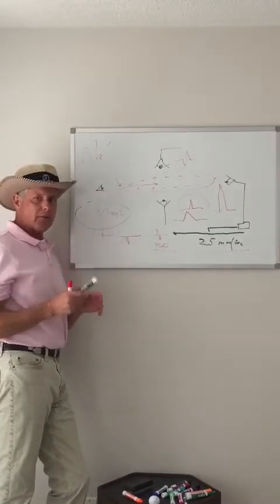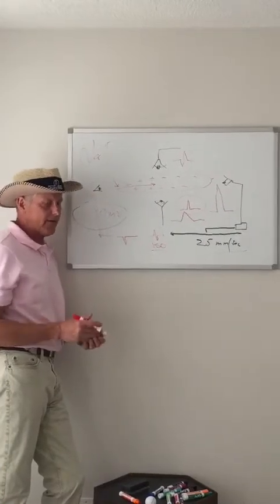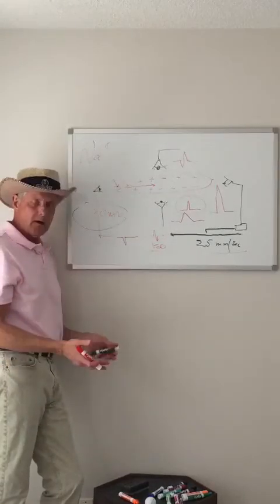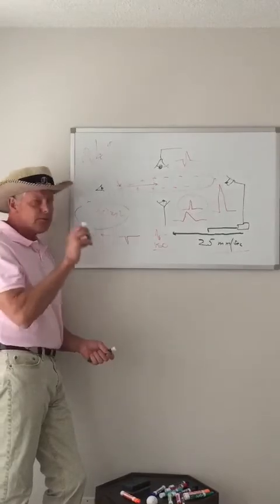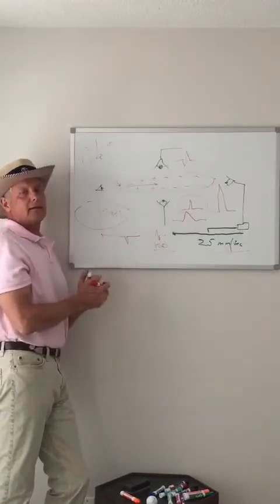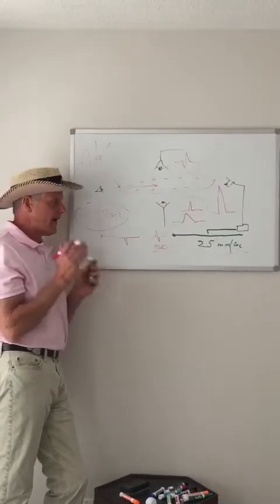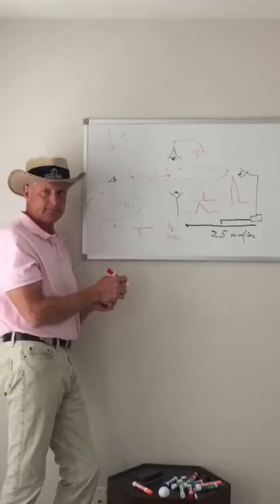depolarizing. So you can predict from that somebody with left ventricular hypertrophy will have very tall complexes or deep complexes. Somebody with a smaller heart that doesn't have LVH or RVH will have smaller complexes. You'll also know that if you see QRS complexes that are too wide, somebody might have a conduction abnormality, but it gets more involved. But you have to understand that before we go any further.